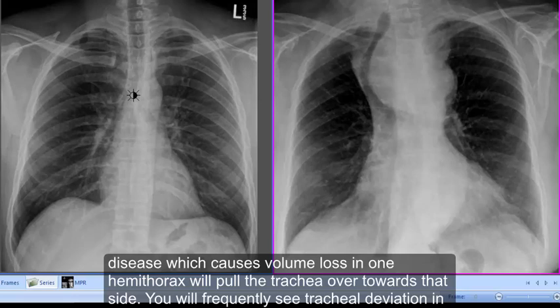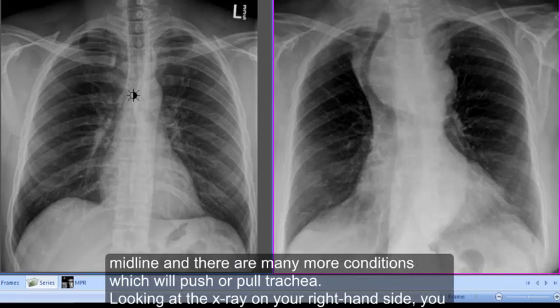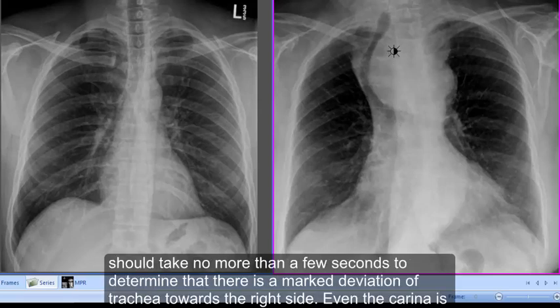You will frequently see tracheal deviation in cases of lobar or whole lung collapses, in cases of fibrosis. The presence of a large mass will also push the trachea away from the midline, and there are many more conditions which will push or pull the trachea.